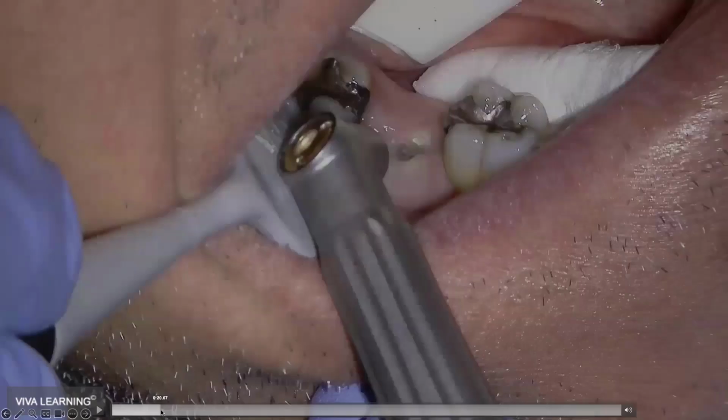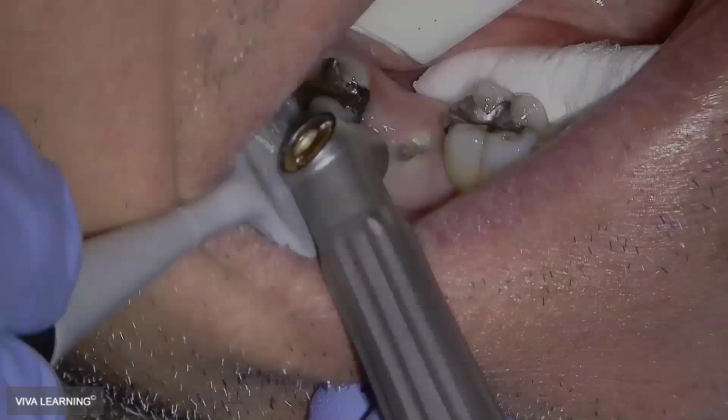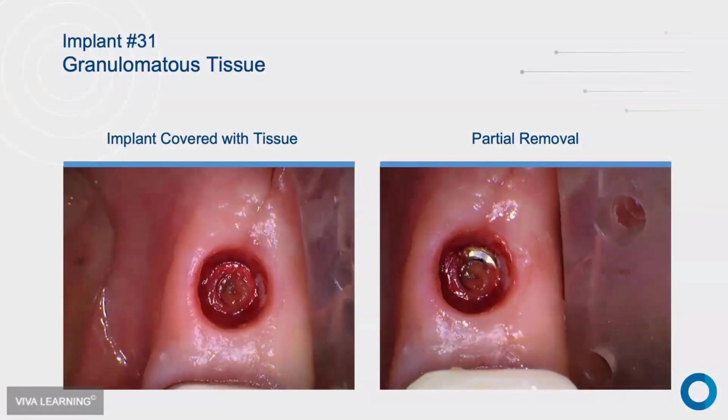see that, what do I do, right? Am I sending that back to the surgeon to fix it? Maybe. Or what if you get a broken implant? This is, by the way, a case for Josh Weintraub on the East Coast. He had this happen where the implant gets loose, gets all this tissue herniated in.